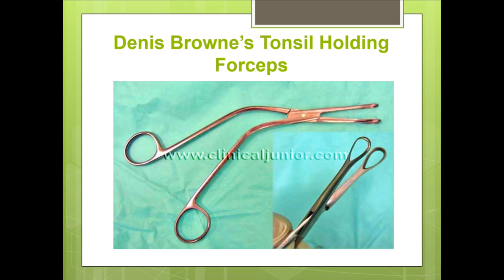This is the second instrument which we will use in the tonsillectomy, the tonsil holding forceps, Dennis Brown's tonsil holding forceps. During the tonsillectomy, dissection and snare or coblation method, we need to hold the tonsil and pull it medially and posteriorly towards the posterior pharyngeal wall, so that there is a reflection of the mucosa over the tonsil to the anterior pillar. So there we will give the cut. This is the Dennis Brown tonsil holding forceps.